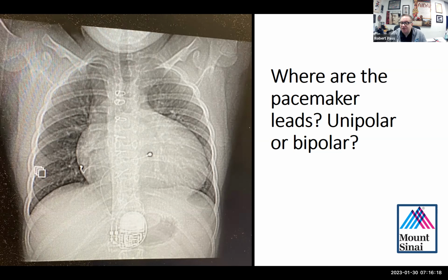So in other words, in the very smallest patients who are requiring this tiny little St. Jude device, the only way to use it is to put a bipolar lead in, and somehow the surgeon virtually always can get the bipolar lead in. So although I think the argument a lot of surgeons will make is that the unipolar leads are better in very tiny patients, in reality, the bipolar leads can pretty much be put in anybody.